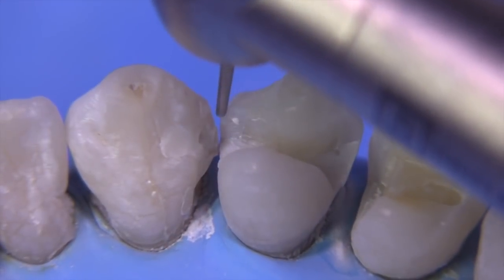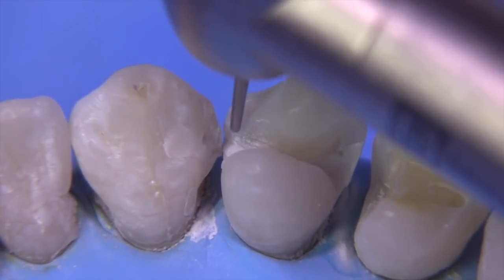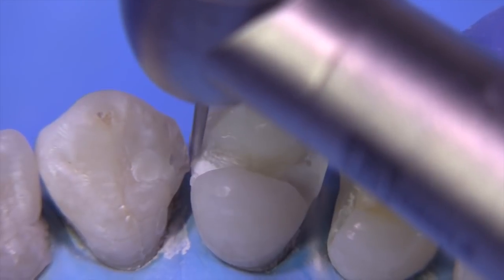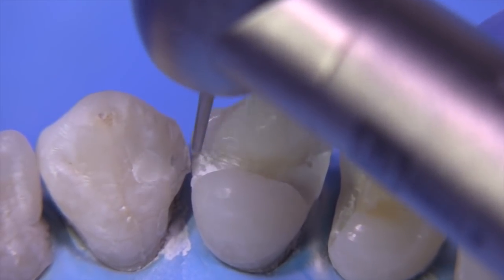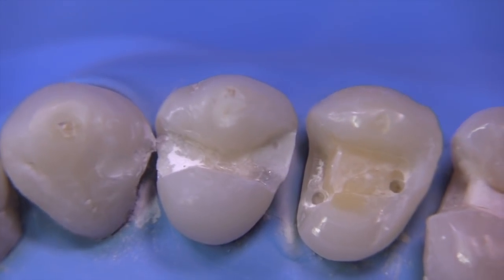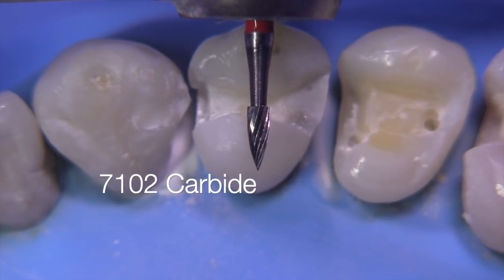This is the 169L because I want to go to a smaller burr when I'm breaking this mesial facial contact, just to barely get past there and keep that more conservative so that we don't show gold when the patient smiles. It's rare that I'm going to do an MOD on a maxillary first premolar clinically. Typically those cases get done with composite, but today we're doing gold.